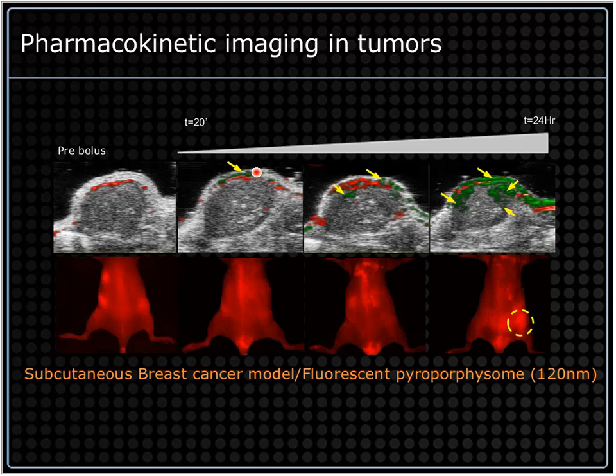And for those of you who use histology in your analysis and in your experimental toolbox, it's nice to see that the signal out here kind of reflects what you see in histology, where you see the increased, this is not expression, but increased presence of the porphysome towards the periphery, and over time it goes along the periphery around the tumor, and then towards 24 hours that it actually starts to invade into the core. It sort of is consistent with histological expression of molecular markers.